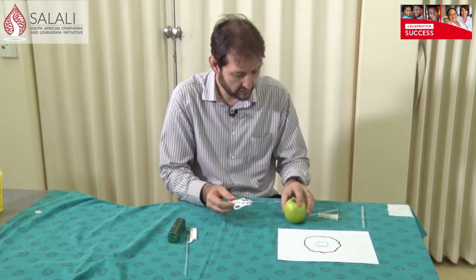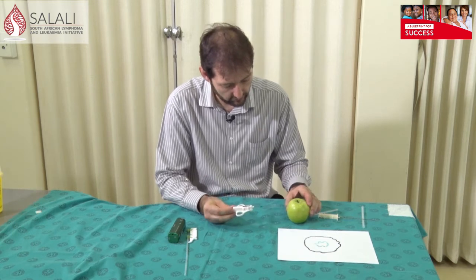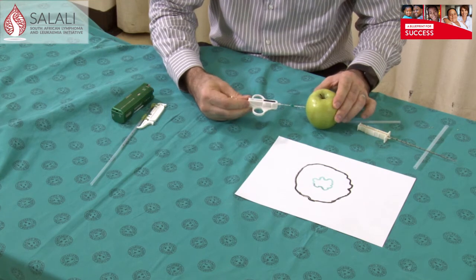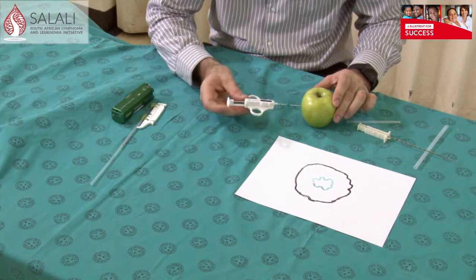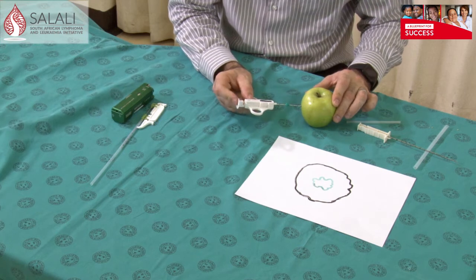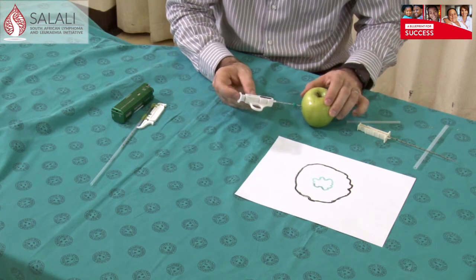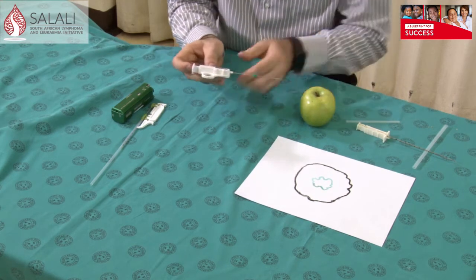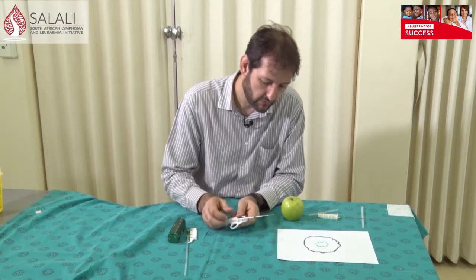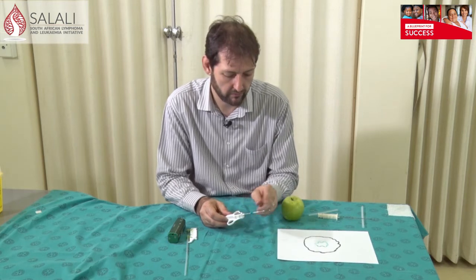Let me demonstrate that on the apple. Pull back on the needle to get it ready for the biopsy. Go through the skin until you are just in front of what you want to biopsy. Push forward and if you are happy with the position into your tumor, just press forward — it will then fire. Remove the needle, pull back to open the cavity, and your biopsy specimen should be in the biopsy port.